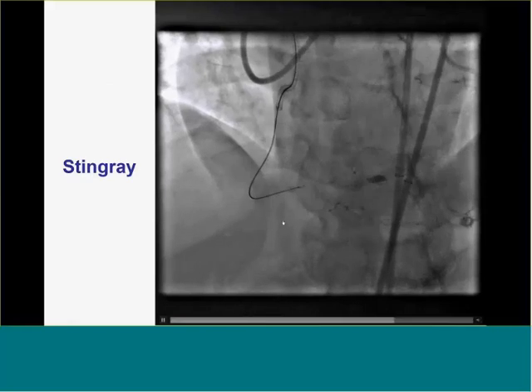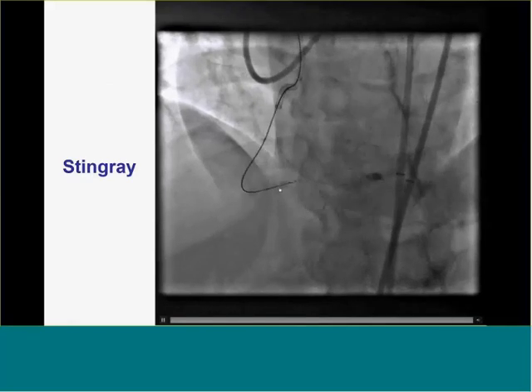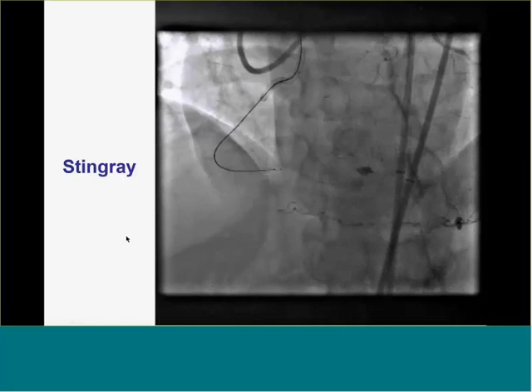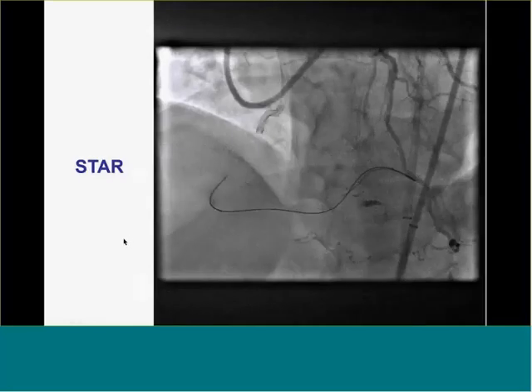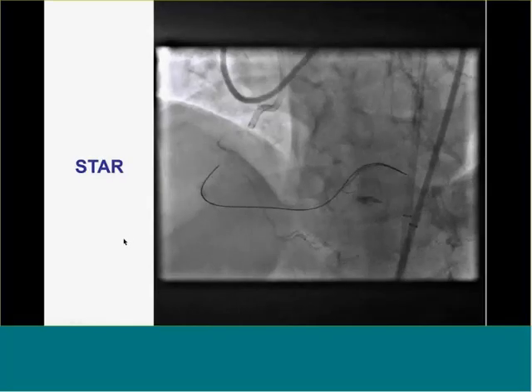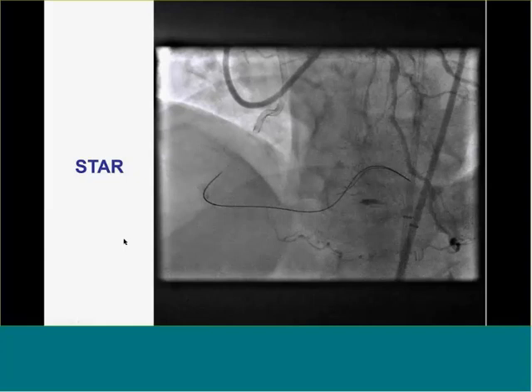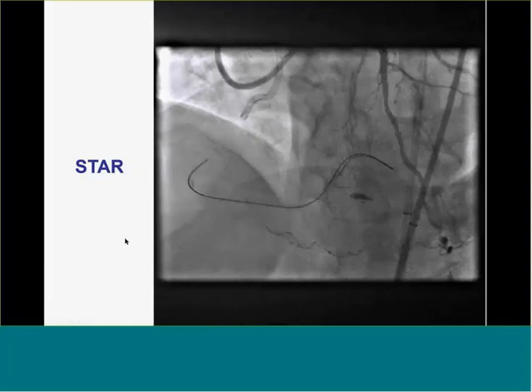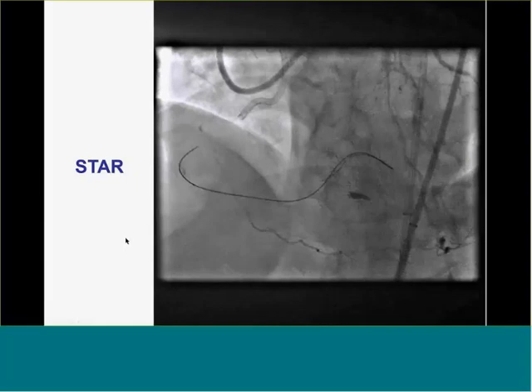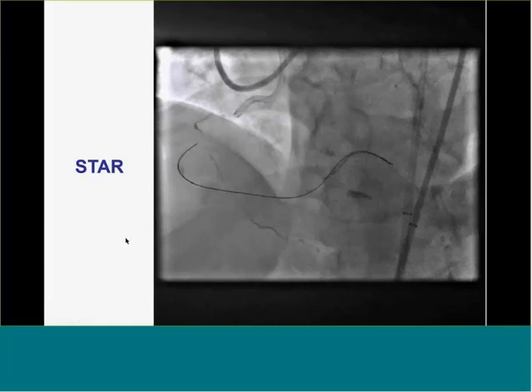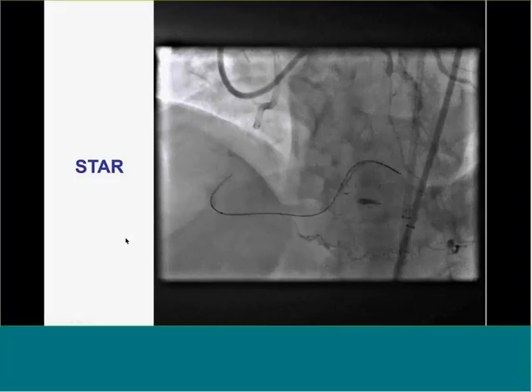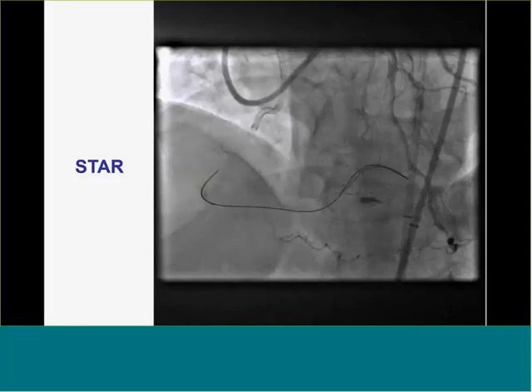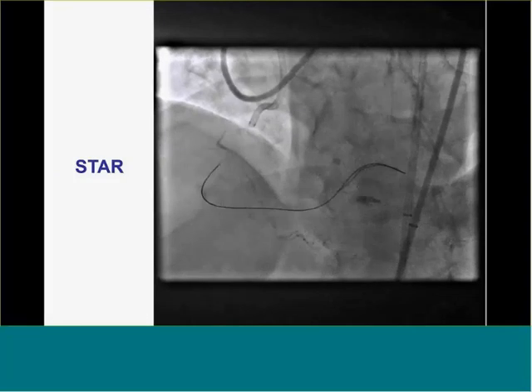Here's the Stingray — not a great view, you can see the two rails, not the best for re-entering. Long story short, it failed again. After multiple attempts using stick-and-swap with the Pilot 200, it didn't work. We did a bobsled going further down, but just couldn't re-enter — it was a very small vessel.